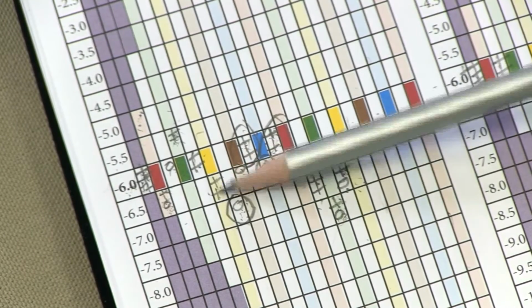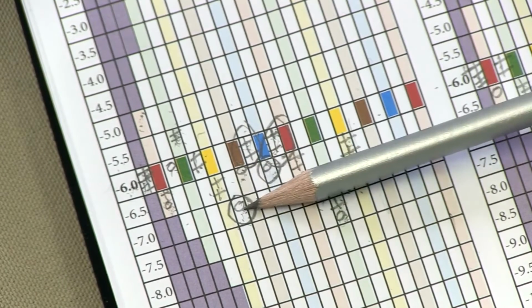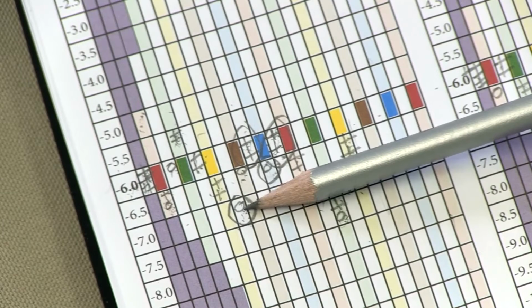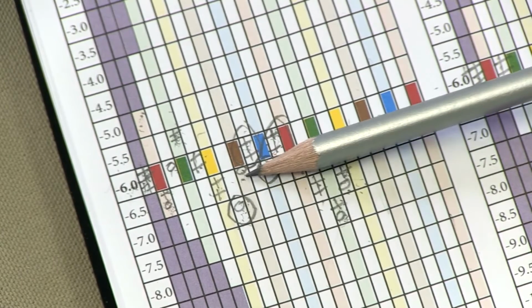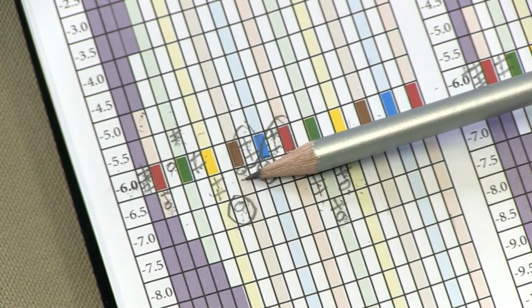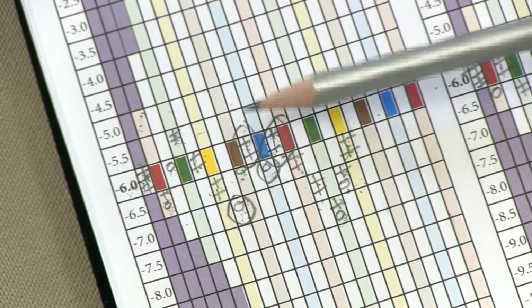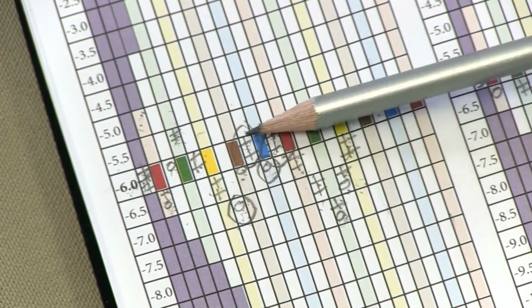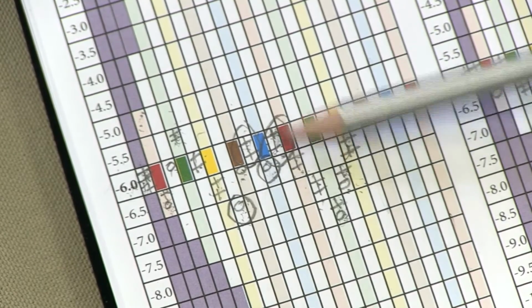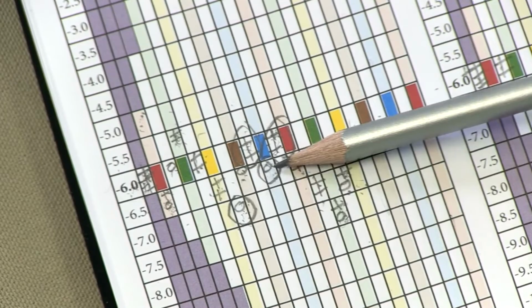Again, we had 2 sets of pairs correct at the next lower level, so we moved down, but we missed the first set of pairs, so we didn't present the second at that level at 10 to the minus 7, so we moved back up. Same thing happened there. We presented 2 stimuli. There was a miss on the first set of pairs, so we moved back up. Then at the next step, we got 2 sets of pairs correct, so we moved down. We moved down, and then we missed the first pair, so we didn't give the second pair.